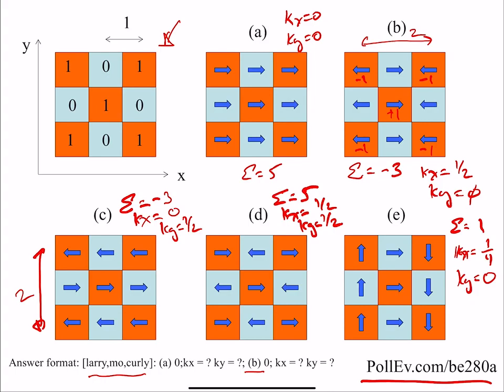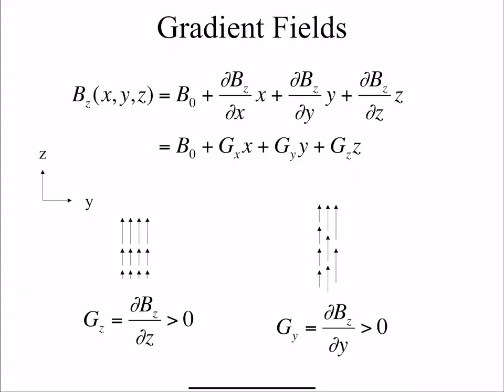All right. So now we're going to transition into figuring out the MRI signal equation, which is basically what is the MR signal that we measure, and then how do we go through k-space. We're going to talk about something called k-space trajectories, which is basically how we cover all these parts in k-space.